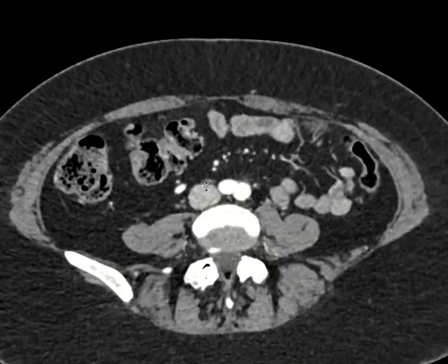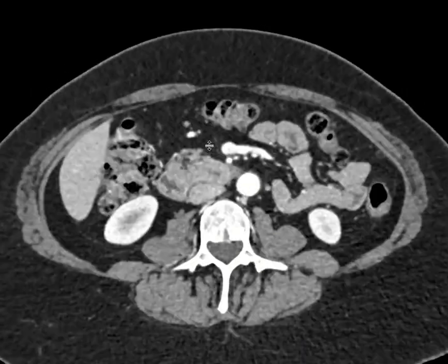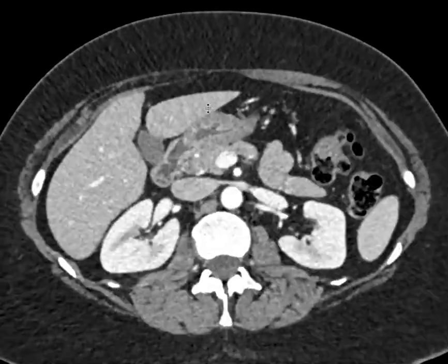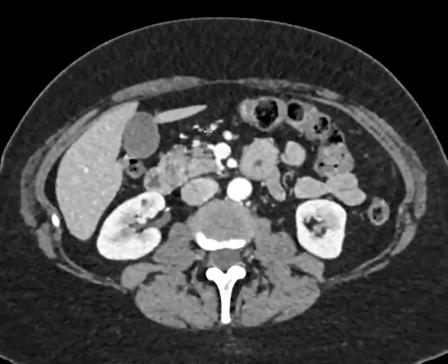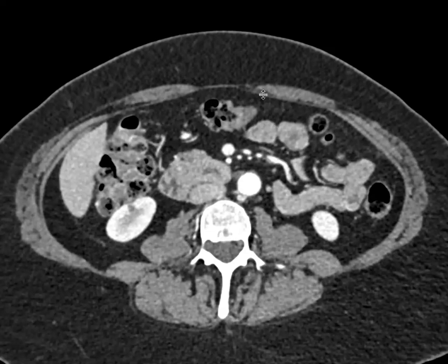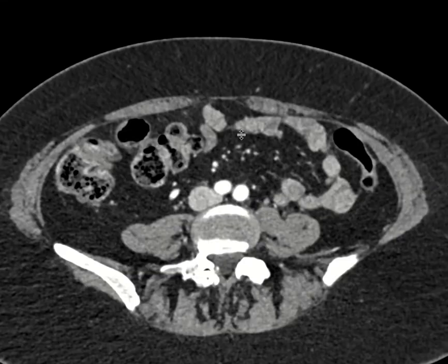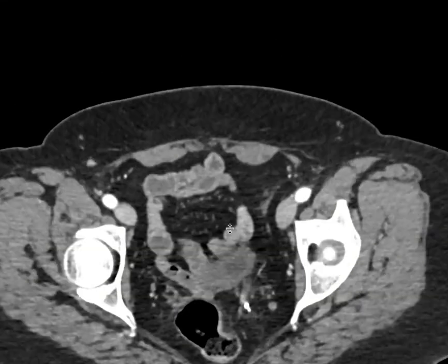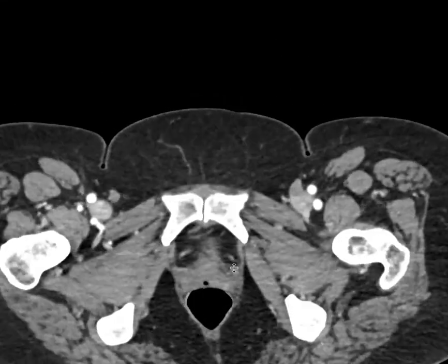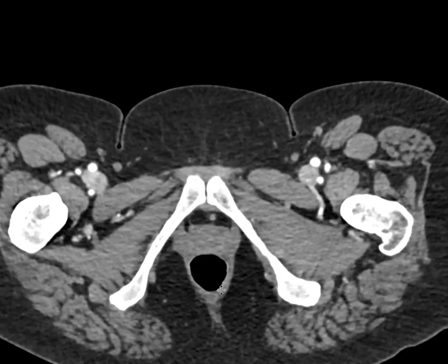Here's a CT scan of the abdomen and pelvis. In this particular case, we're going to try to find the appendix, and I'll show you the approach that I use to help identify it.